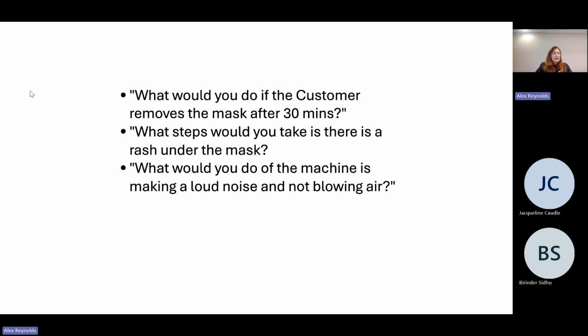Do a Riskman incident report, check the mask and check the fittings. It may have a bit of grit or something and not be properly clean underneath it, and that's causing the rash. Good job.